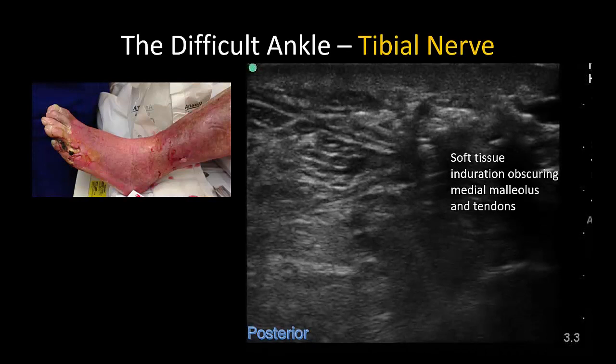Ankle blocks are useful for forefoot debridements and amputations. However, these patients often have edema and soft tissue induration that can make imaging more challenging. In this ultrasound image, recognition of the usual landmarks is impaired. However, the hypoechoic posterior tibial vessels are still identifiable by their appearance and pulsatility. The expected fascial envelope around the nerve can also be distinguished if you know what to look for, and from these two landmarks the location of the tibial nerve can be inferred.